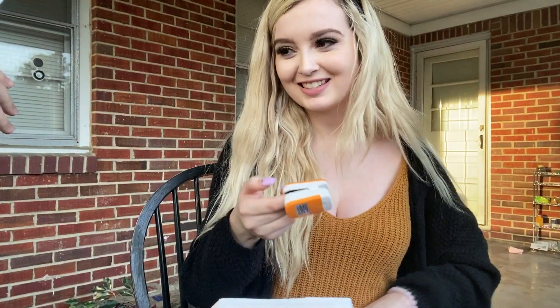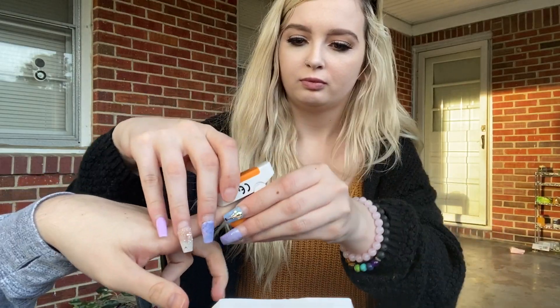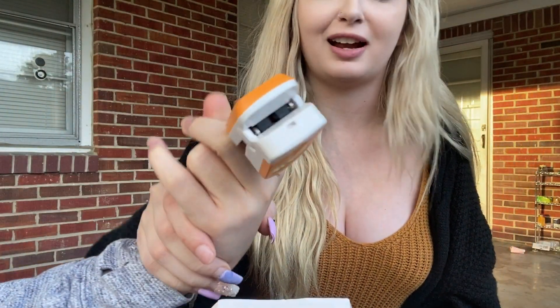Let's try your finger and see what it says. Stick your finger in the machine. Let's see if you're as healthy as I am. Is that 86 or 98? 98 — we're both the same. My blood pressure is 117. It's higher? Yeah, is that bad? It's like my heart rate.